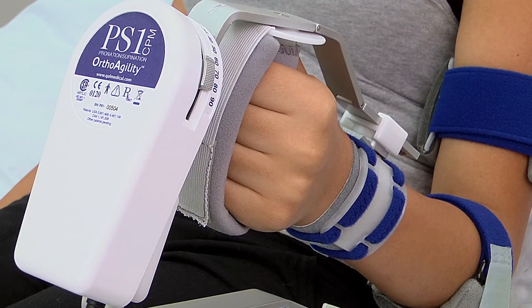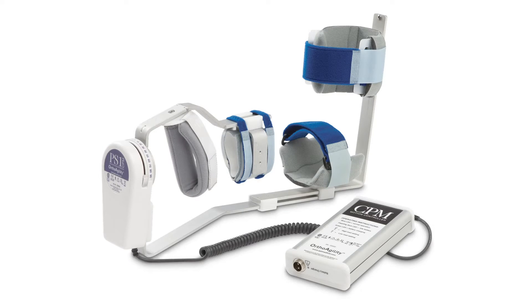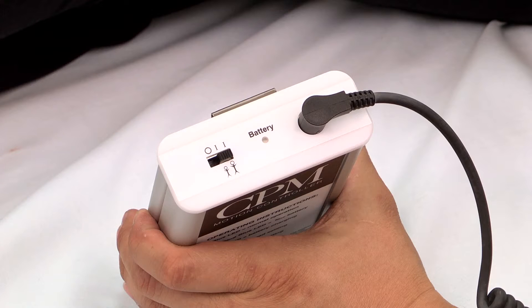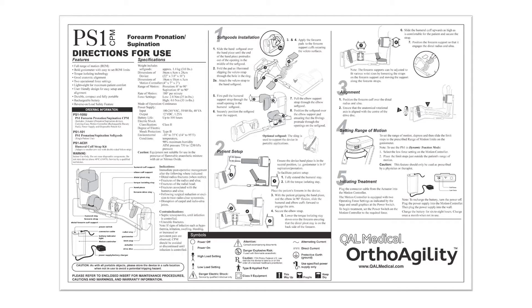Each PS1 comes with a carrying case, CPM actuator, CPM controller, power supply, soft goods, and directions for use.